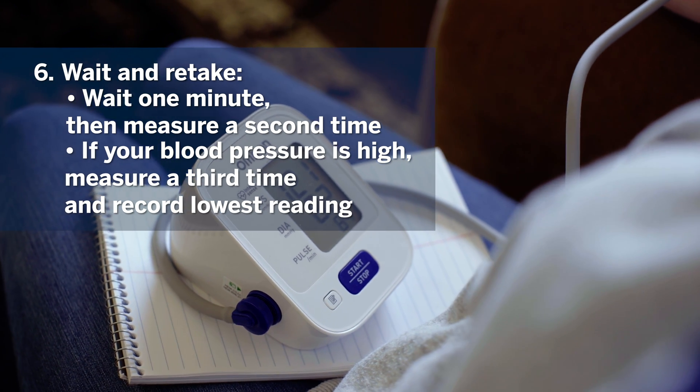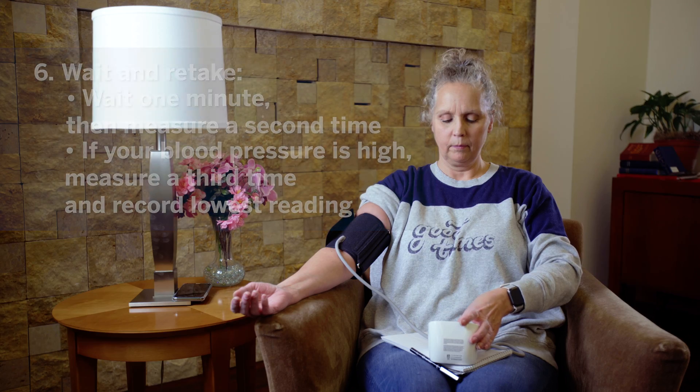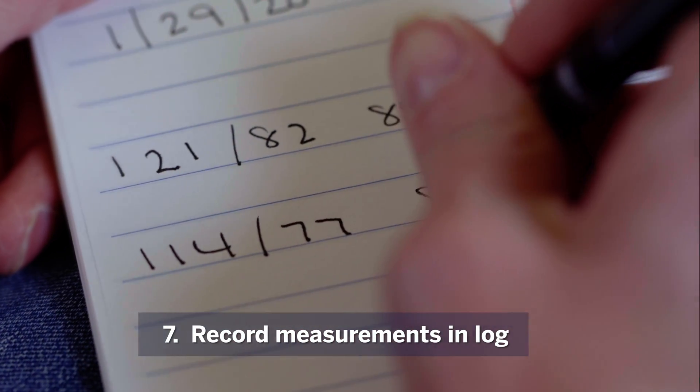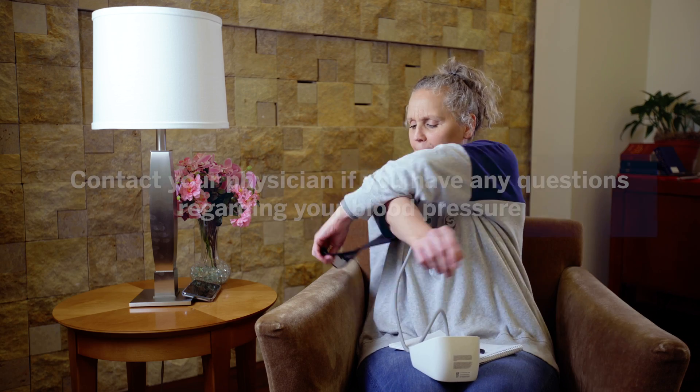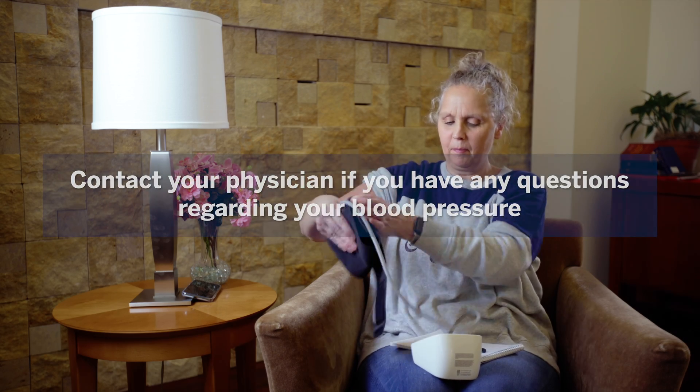After the reading is complete, wait one minute, then measure a second time. If your blood pressure is high, repeat the reading a third time and record the lowest of the two. Finally, record your measurements in your blood pressure log. Be sure to contact your physician if you have any questions or concerns regarding your blood pressure readings.